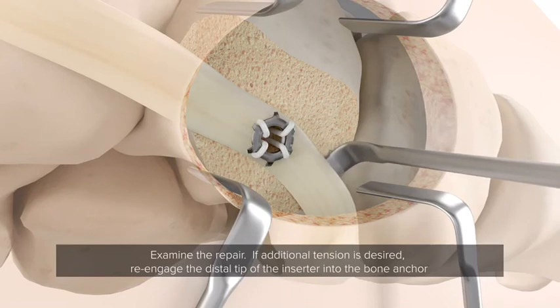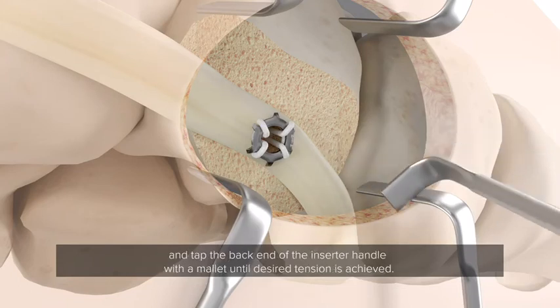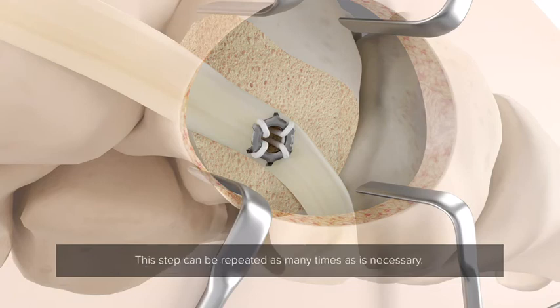If additional tension is desired, re-engage the distal tip of the inserter into the bone anchor and tap the back end of the inserter handle with the mallet until the desired tension is achieved. This step can be repeated as many times as is necessary.